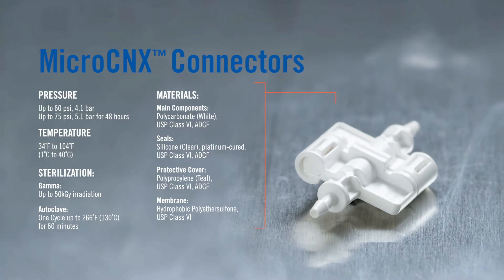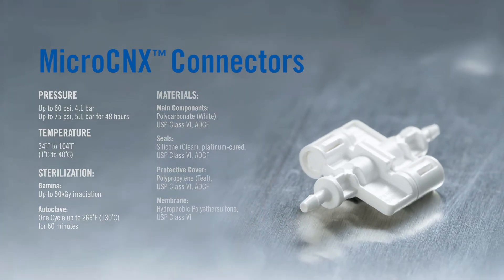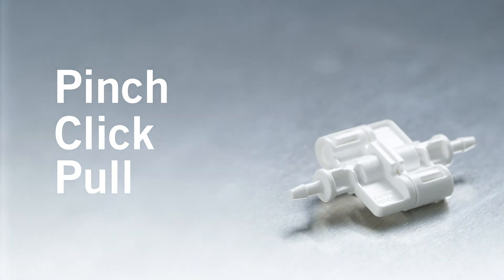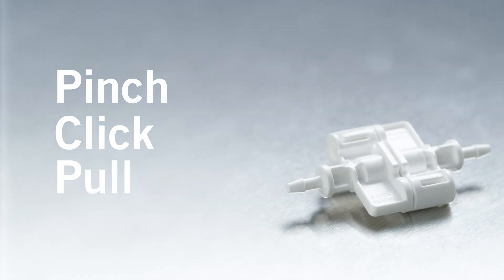Assembling the MicroConnects is a quick and easy three-step process. We pinch, click, and pull. Follow these steps to ensure a secure, leak-free connection.